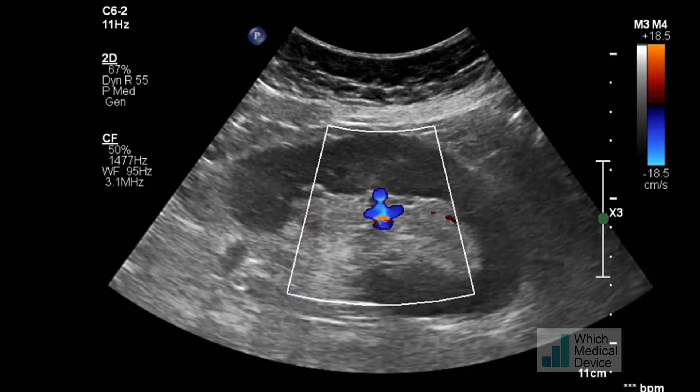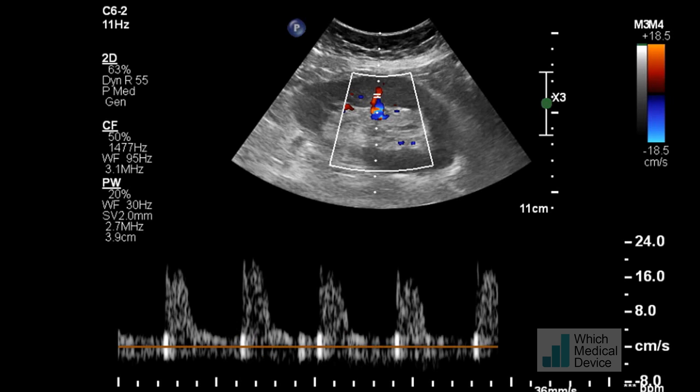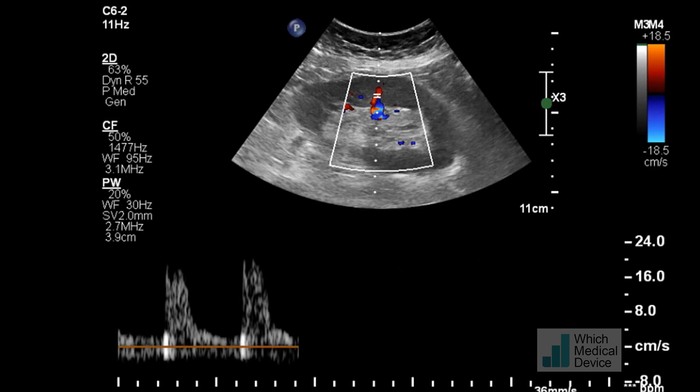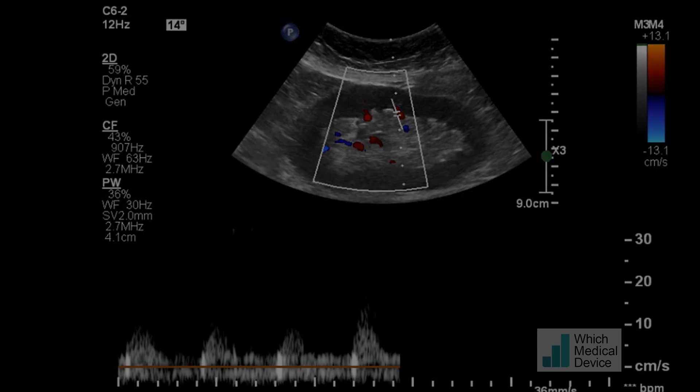Looking at Doppler afterwards, just visually it looks better. And look at the waveform — there's a very straight upstroke to that systolic waveform now, which is what you'd expect to see. The previous waveform was quite damped. Overall, this has been a technically successful procedure. Time will tell as to whether the kidney can recover from the ischemic insult this late post-transplantation. Thank you.